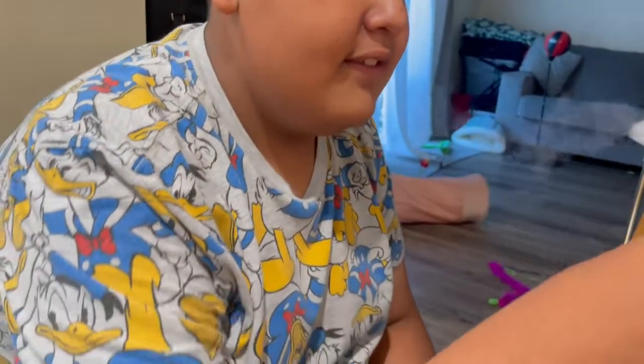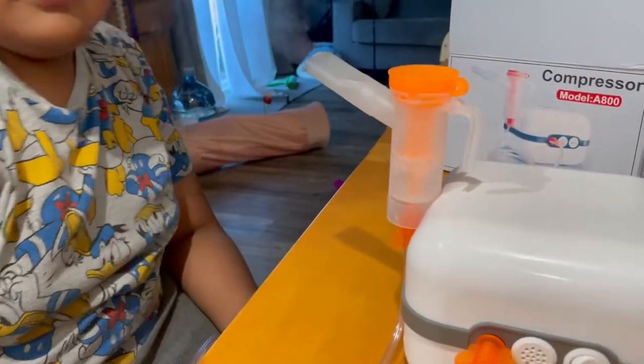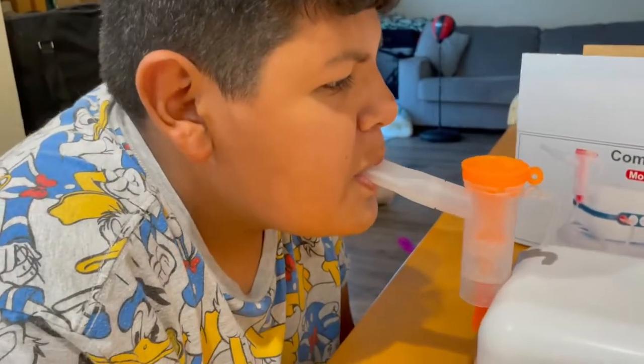Okay, let's say you need to go to the restroom — it has a little spot here and it'll hold it for you. Or if you don't want to hold it yourself, just have medication in your face — there you go.